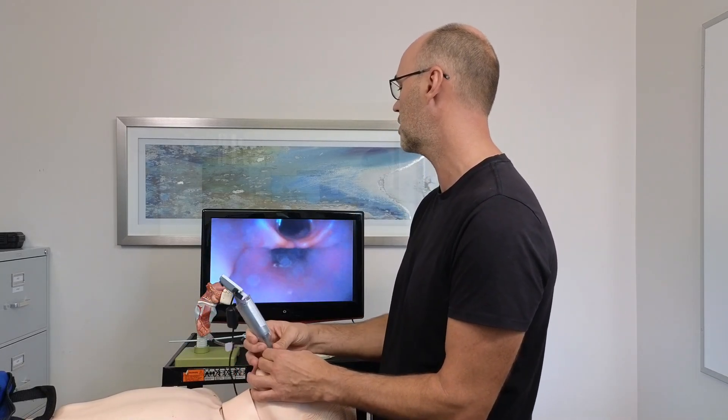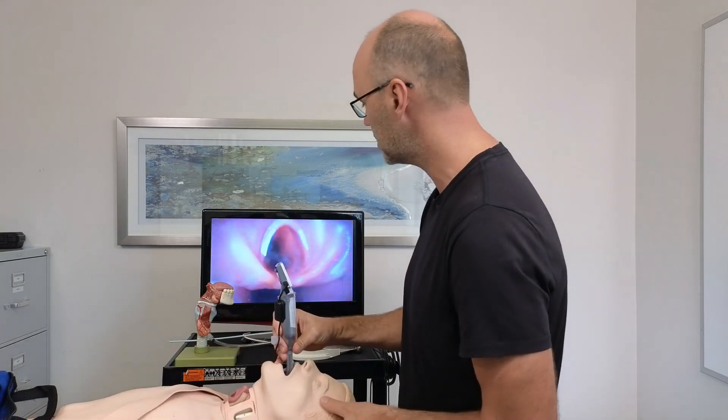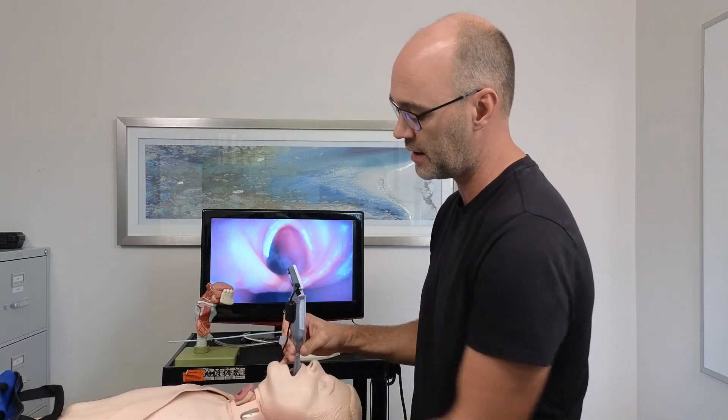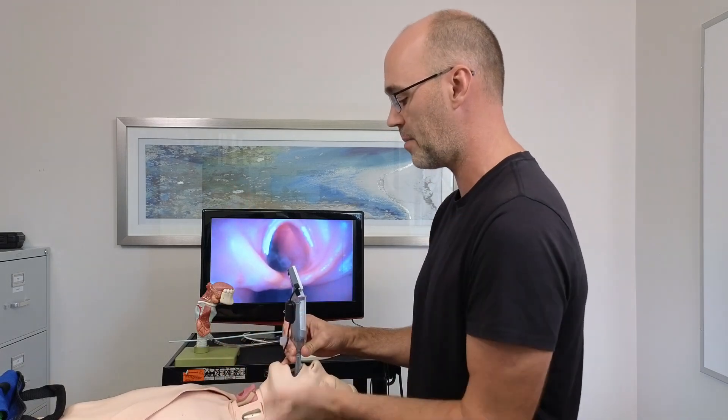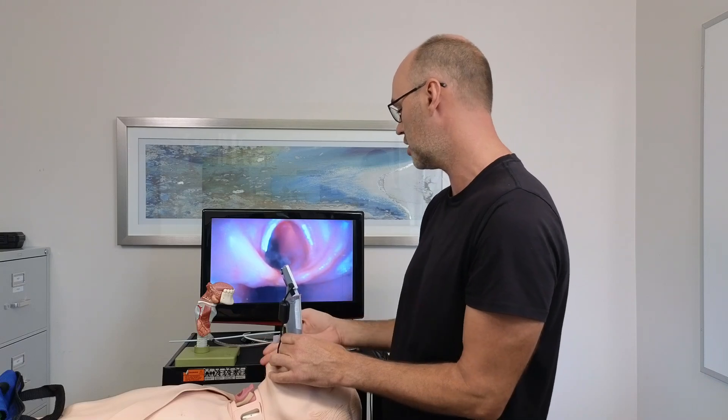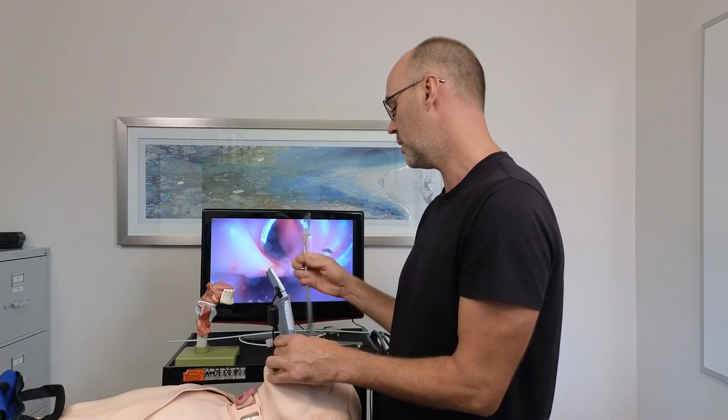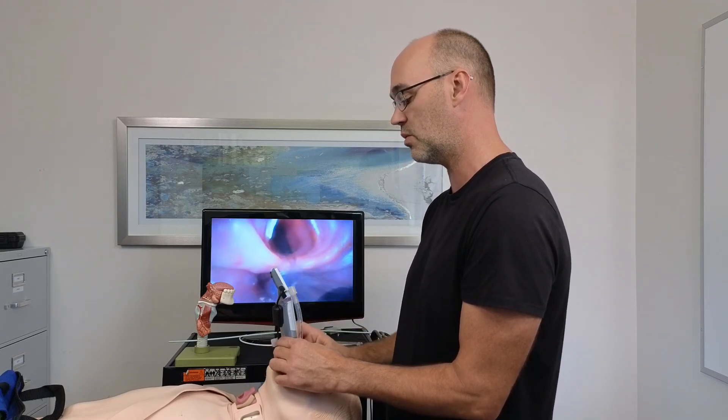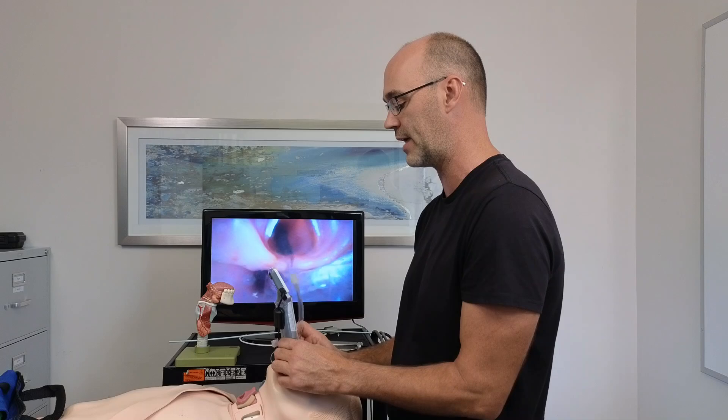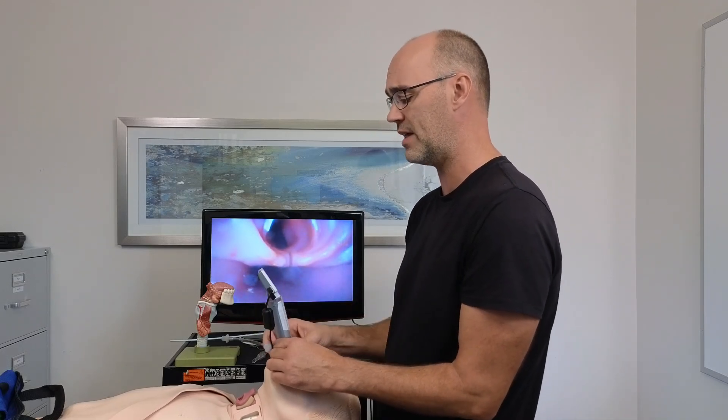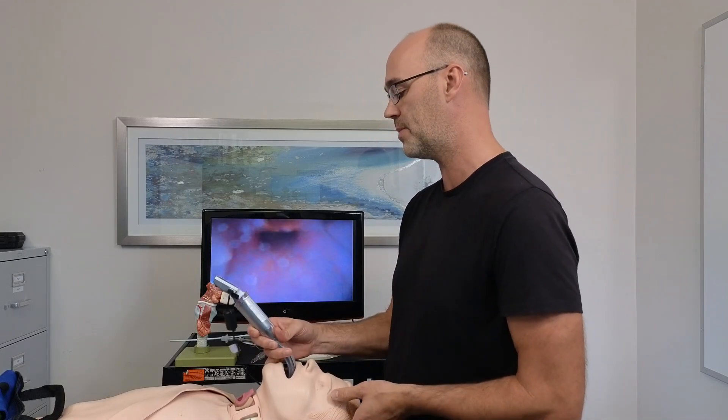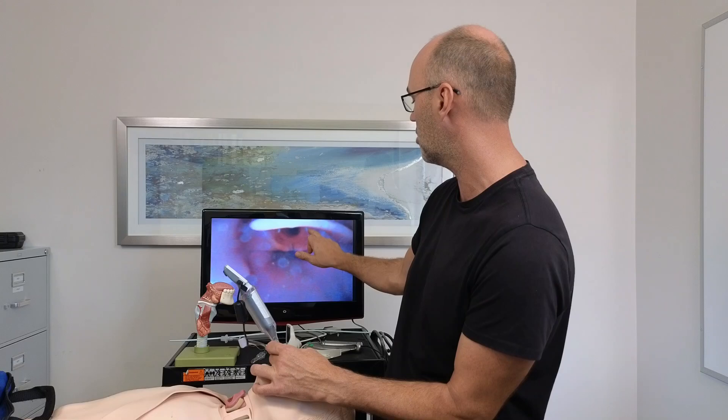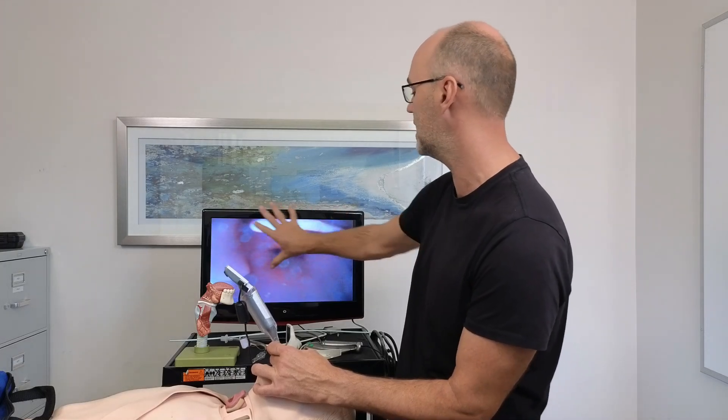Now, a temptation can be to go in with a hyperacute angle blade and get this kind of a view. Now, you'll watch as I kind of pull back here a bit, do you see what happens to the glottis itself? I actually move the glottic airway quite significantly superior from my perspective or more anterior, which is going to make a more difficult curve to get to. So when I'm advancing the tube, even with the channel device, what we can do, it can be immensely frustrating, is that we just get to watch ourselves intubate that stomach or the esophagus over and over again. So better with a hyperacute angle than this view for placing the tube would be to back up, get your view, get back in what George Kovacs would call a 50-50 view, where I see 50% of my glottic opening and the glottic structures is only taking up 50% of my screen.